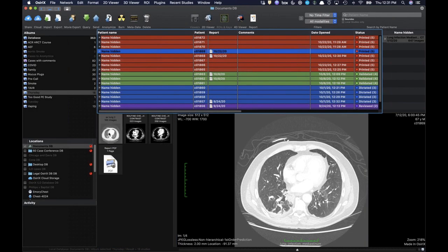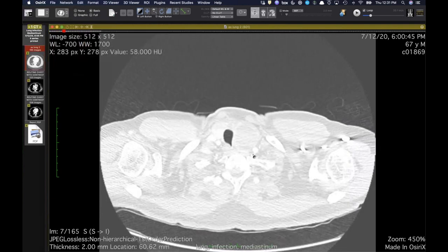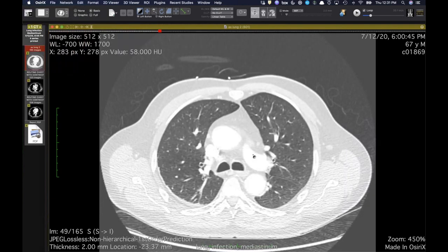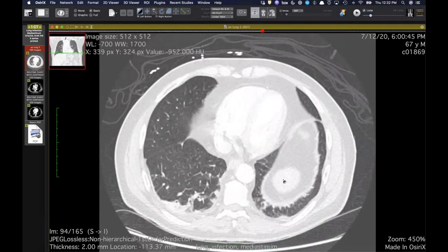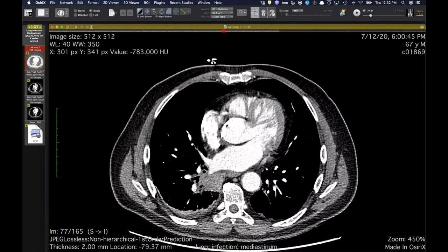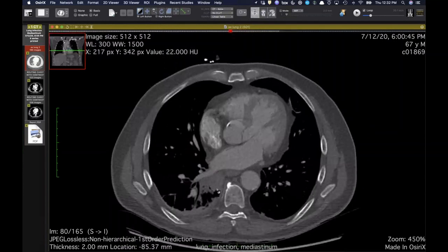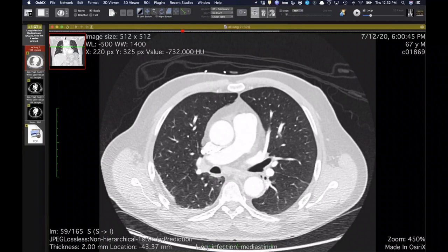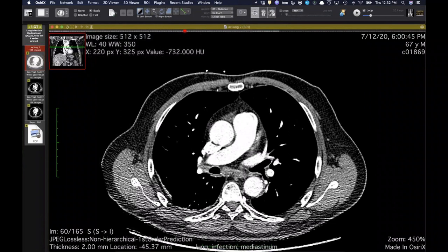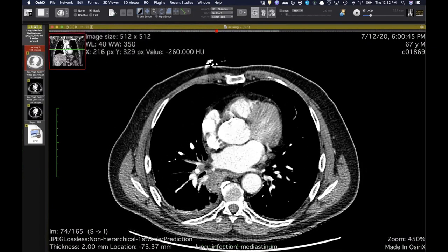All right, now I've got a couple more on a theme. So this is a patient who is in his 60s and he's got a multinodular goiter, but had abdominal pain, diarrhea, ended up having hepatitis E infection of his liver. And at the time of having an abdomen and pelvis CT, they noticed this right lower lobe mass, or maybe more appropriately, mass-like area of consolidation. So he underwent a chest CT, had some not really that impressive subcarinal and right hilar lymph nodes.